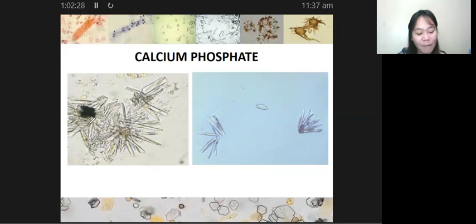Flower-like, okay? Bakit kaya hindi lilet, 'di ba? Lily, lilet. Bakit kaya rose, rosette? Okay, hindi ko din alam. Bakit kaya hindi, ano pa ba yung mga flowers natin? Orchidet. Mga ganun. Hindi ko din alam. Okay, daisiet. Mga ganyan. Okay, so anyway, rosette. Rosette, flower looking siya.